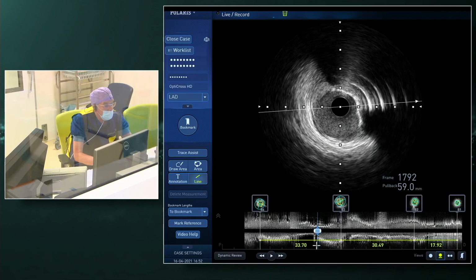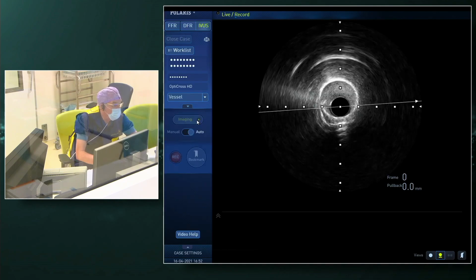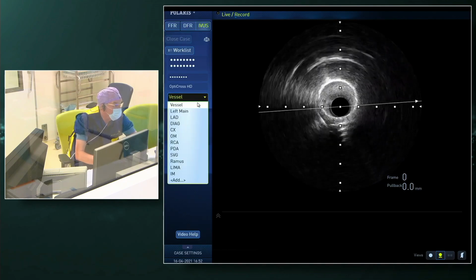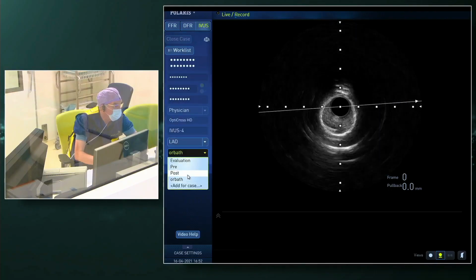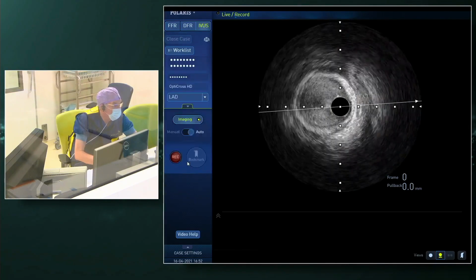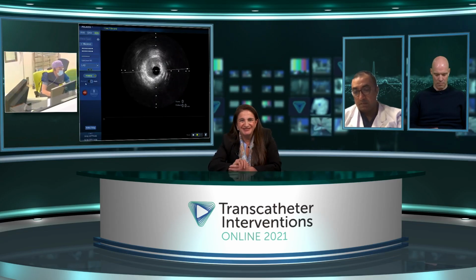Can we put the IVUS on live again? Yes, we do. Just for a moment. We also changed the Viper wire for a standard wire in the meantime. Oh, great. That's great. So we always have about 3 minutes. And, yeah, go ahead.